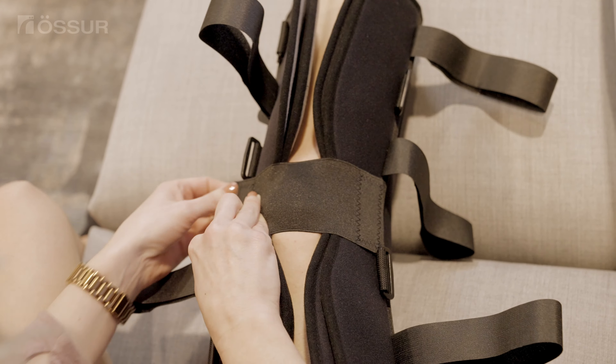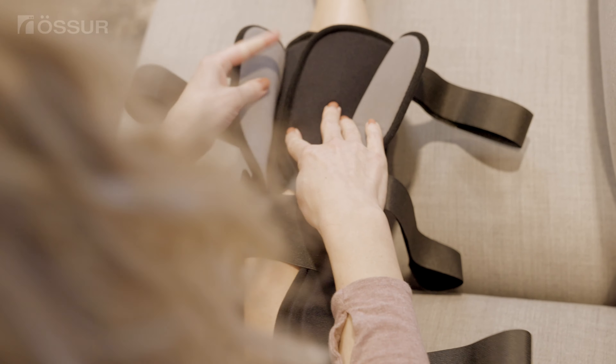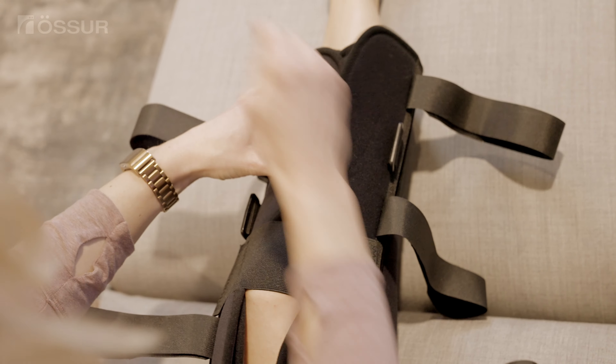The elastic patella cover can be used to help initially hold the panels in place. Fold the panels on top of each other before fastening the straps.